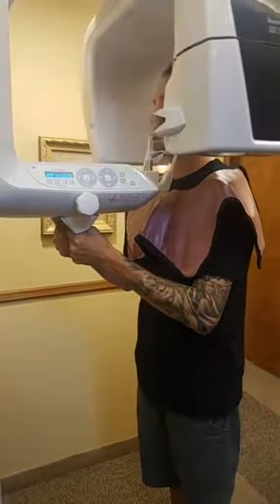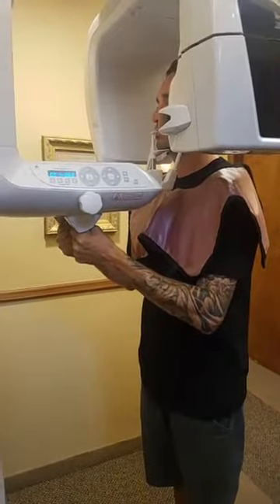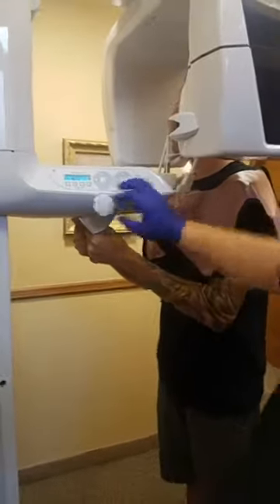And there we go, 9.4 seconds, and we actually have an image. I'm going to go ahead and let David out of the machine here. David, you all right? Okay. And what we'll do is we'll actually back up, and I'll show you on our computer screen what it actually did.